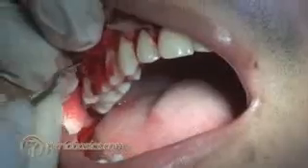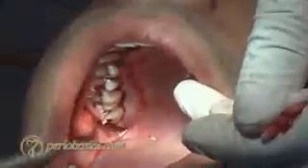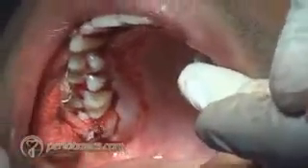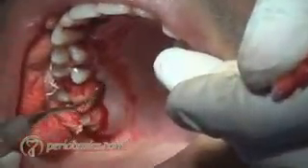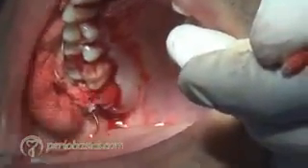As we have complete access to the root surfaces now, we can do root planing along with this procedure. So this is how we remove the granulation tissue and the tissue tags.